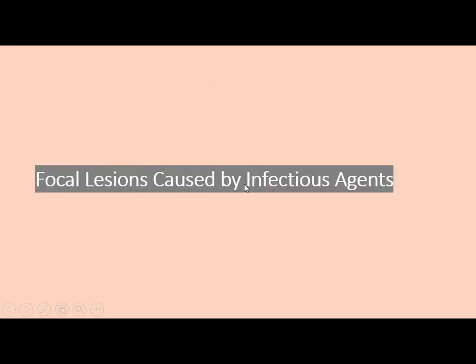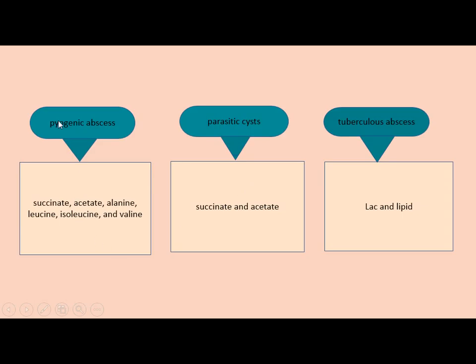Focal lesions caused by infectious agents: we have pyogenic abscess, parasitic cysts and tuberculous abscess. In cases of pyogenic abscess, we have elevated succinate, acetate, alanine. In parasitic cysts, succinate and acetate will be elevated, and tuberculous abscess will show lactate and lipid elevation.